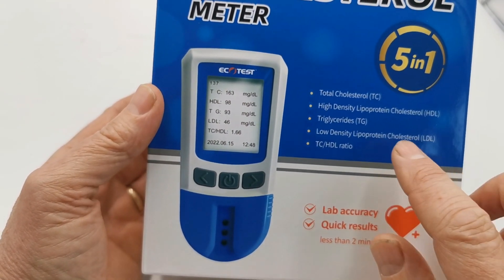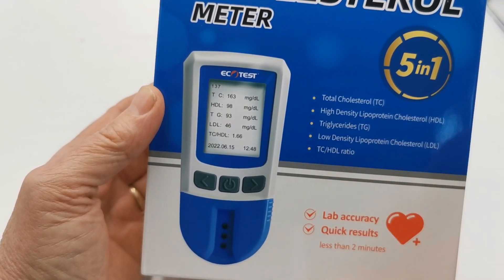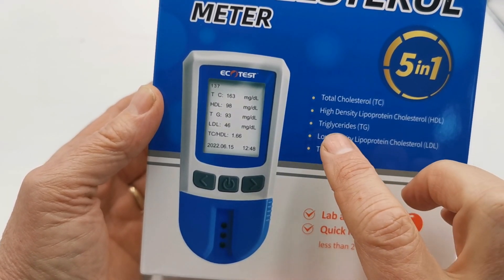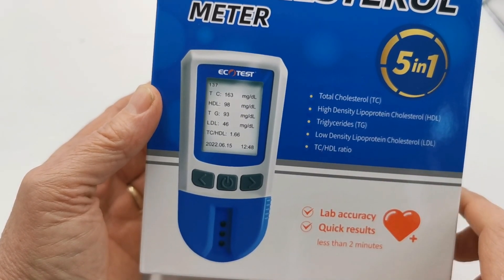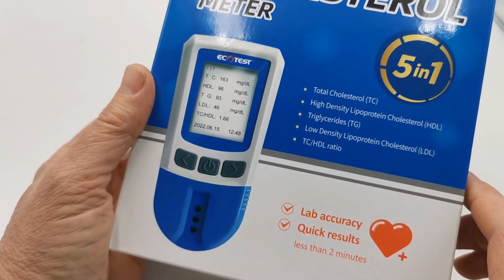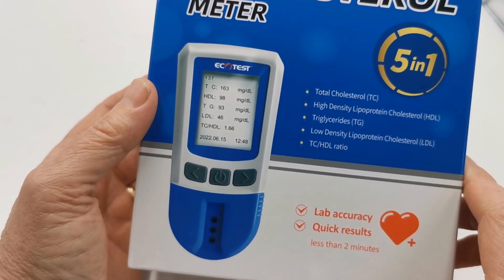The meter allows you to detect and measure total cholesterol levels, HDL or high density cholesterol levels, triglycerides, low density lipoproteins or cholesterol levels, and the meter will also electronically work out the total cholesterol to HDL ratio for you.